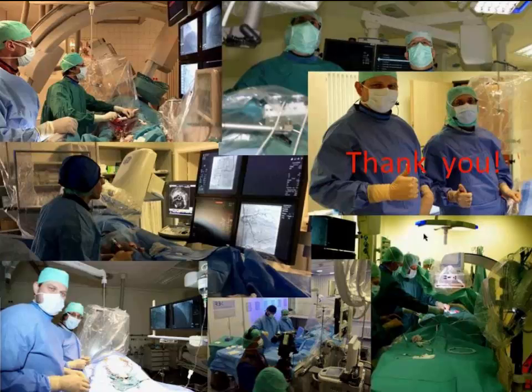The important thing is that I like the way you handled it, that you didn't remove everything. You just left it there in the meantime, because you have to get the lesion treated anyway, and then you fix it at the end. So that's nice. You didn't have continued bleeding during the case. That's a great tip: if you have this perforation, leave the catheter there until you're able to treat it. Is that how you approach those?